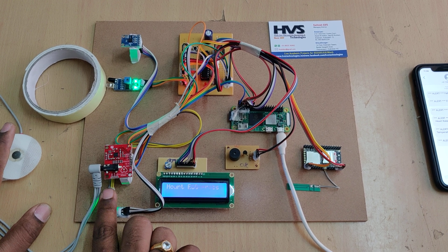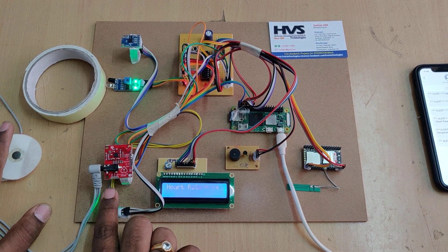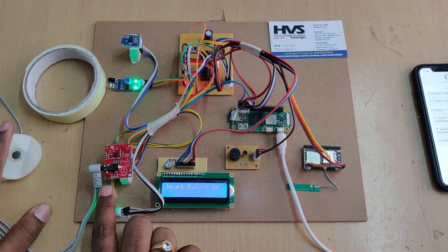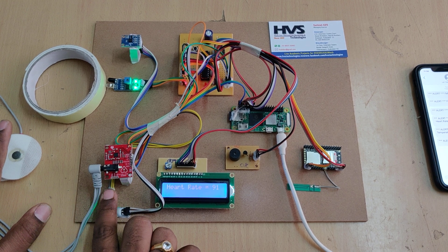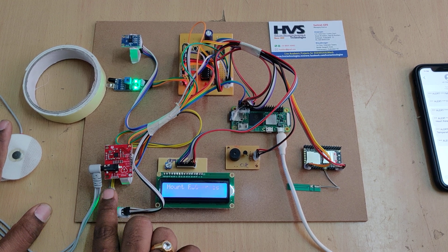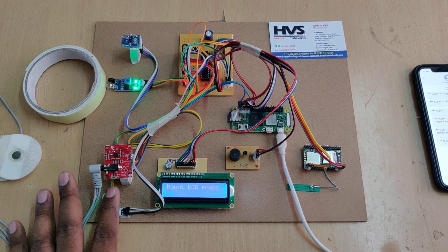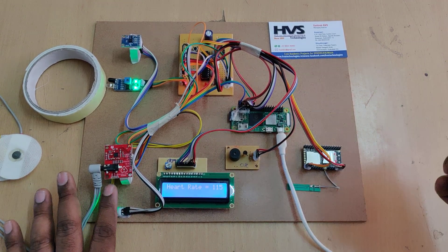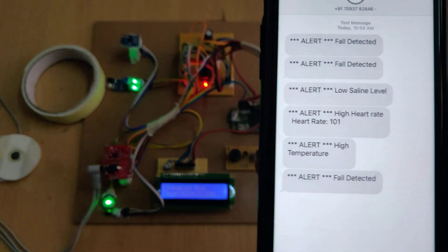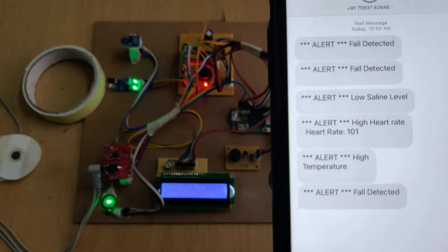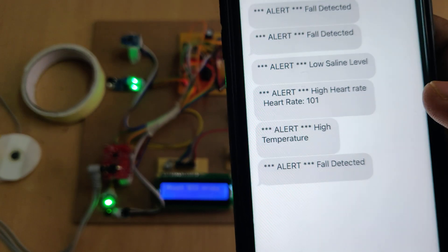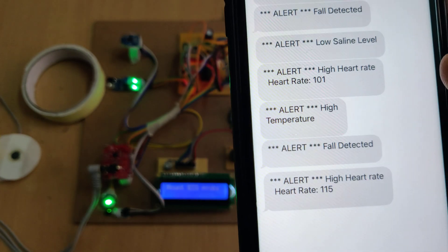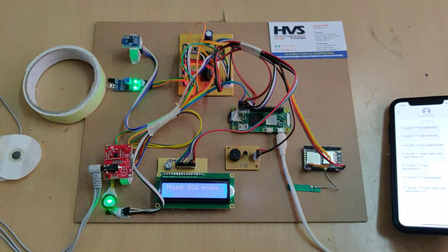To test malfunctioning, tap the finger pulse sensor to create abnormal conditions. The system will provide alerts for fault detection, low saline level, and high heart rate. We just received a high heart rate message.